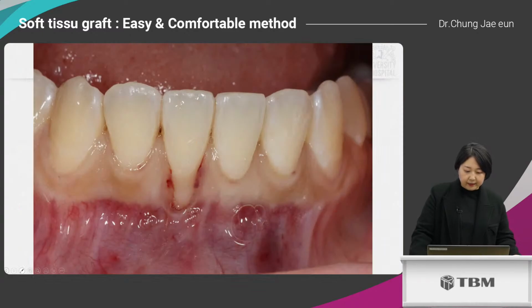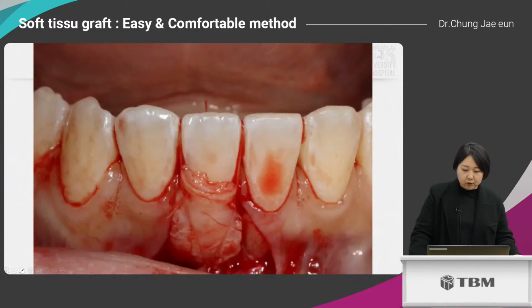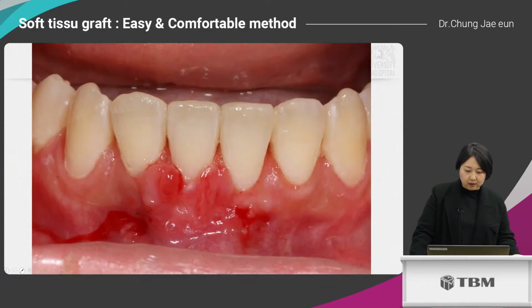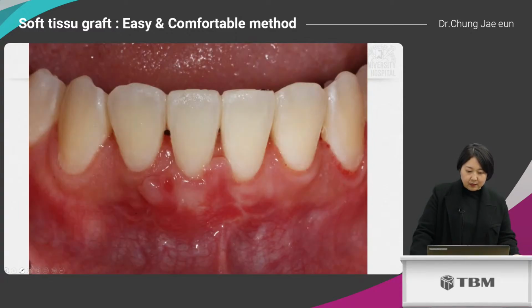This is another case, very similar. I did root coverage using DGG as usual, and a coronally advanced flap was done, and this is 8 days after the surgery, and 3 weeks after the surgery.